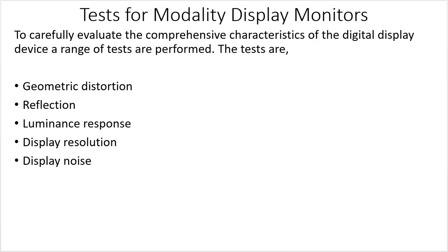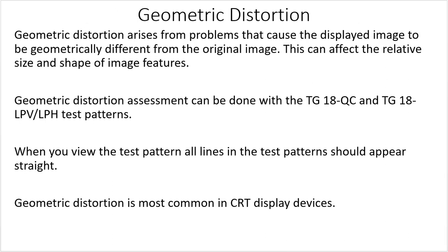Tests for modality display monitors. To carefully evaluate the comprehensive characteristics of digital display devices, there's a range of tests you need to perform, and they are geometric distortion, reflection, luminance response, display resolution, and display noise.